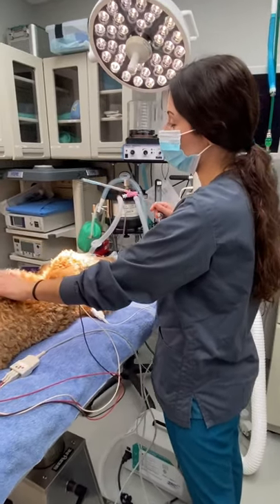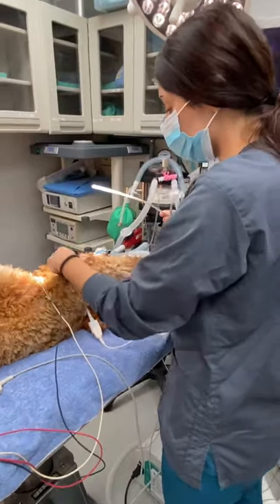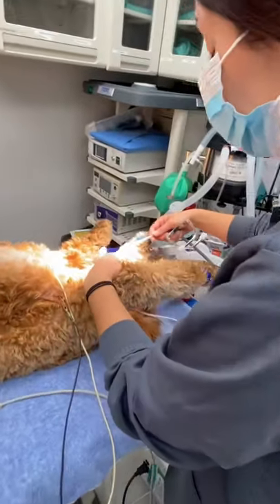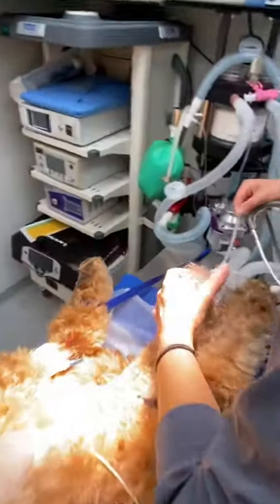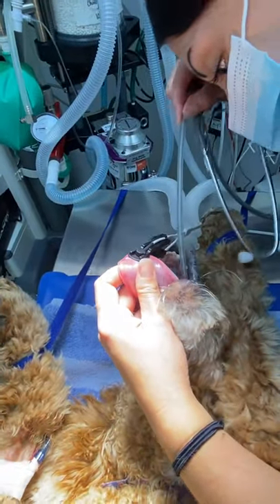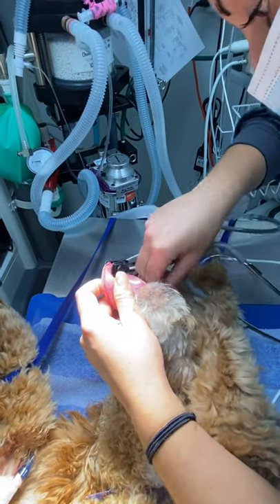Okay, so now we're going to place the esophageal stethoscope. I like to measure for this — just down to the thoracic inlet. When they're intubated, you go in the right little spot and basically just work it its way down.